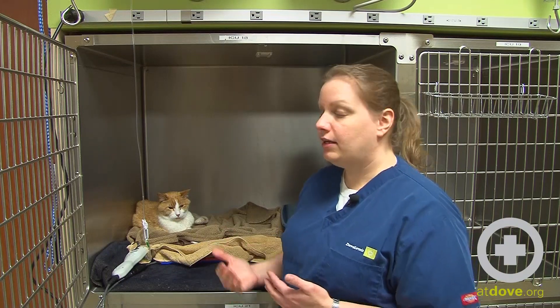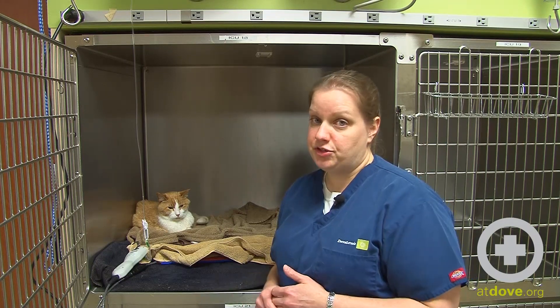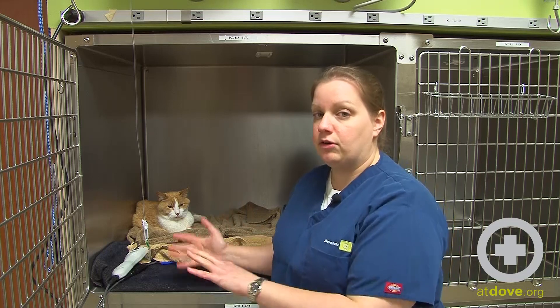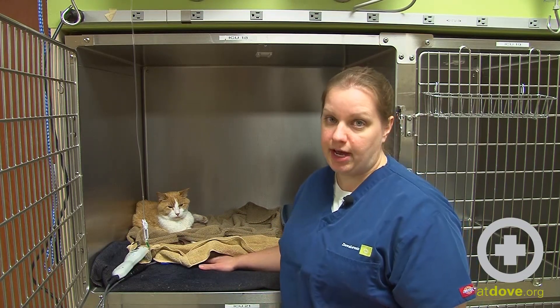A bear hugger is great for a recumbent patient, but when you have a cat like this who is suffering from chronic renal disease, these cats often have low temperatures. They don't want something loud and blowing on them, and they will often crawl away from the heat source. So that's when we move to the cage pads.